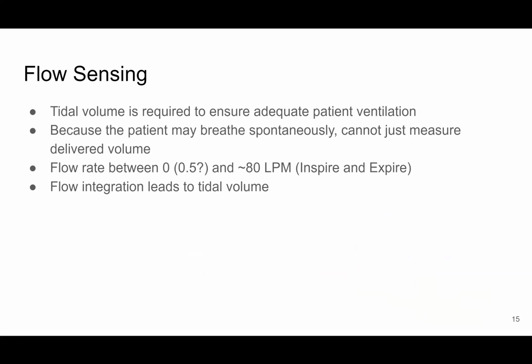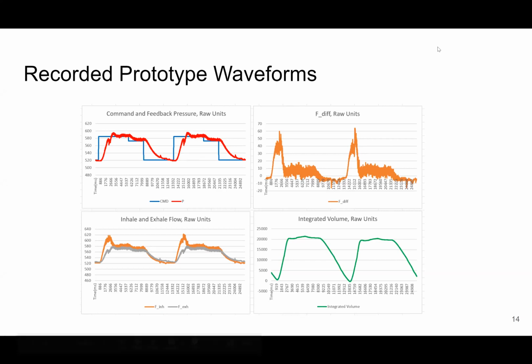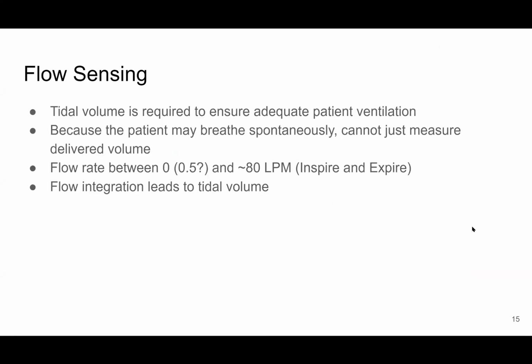So if you just go with a pressure cycle device, it's very easy to underventilate, and it's as well pretty easy to overventilate. So if you're not getting that feedback to the machine, I think that's to the point where we're not kind of meeting our minimum viable product.